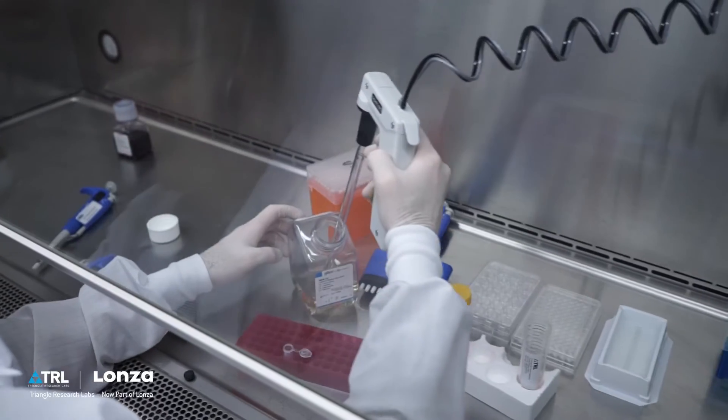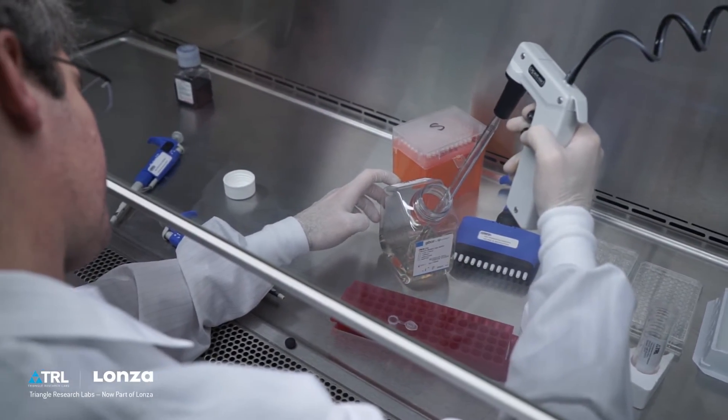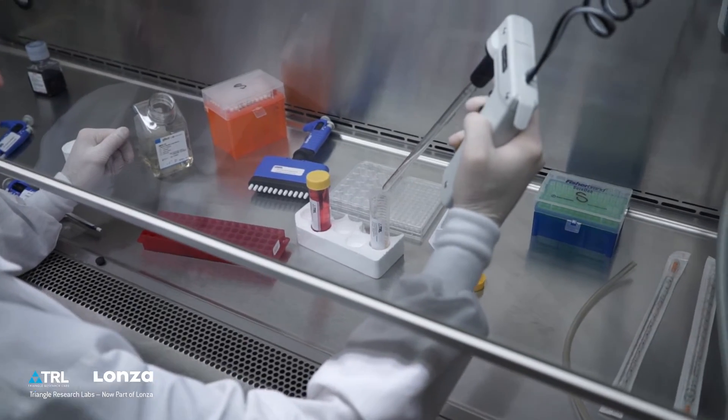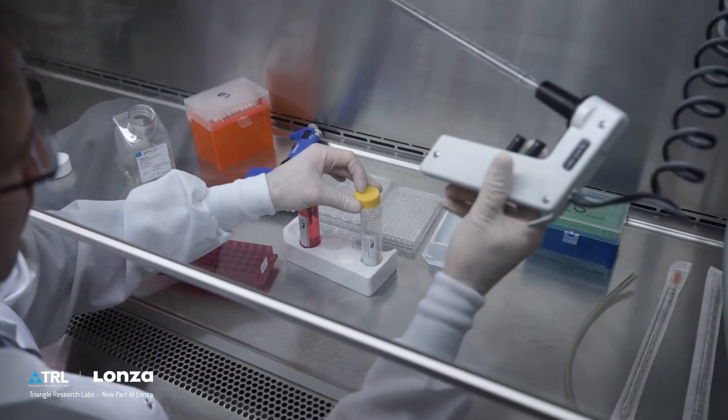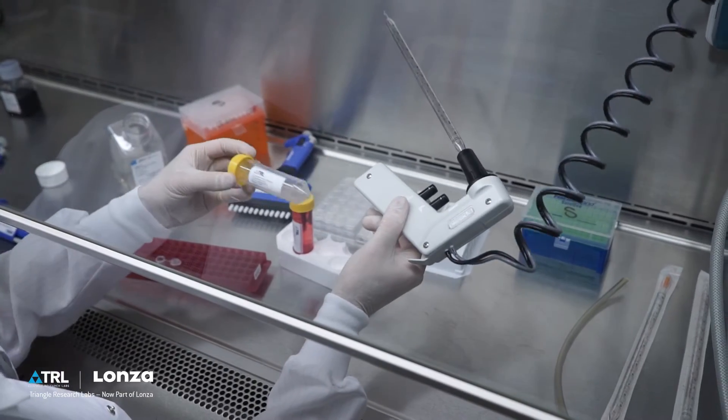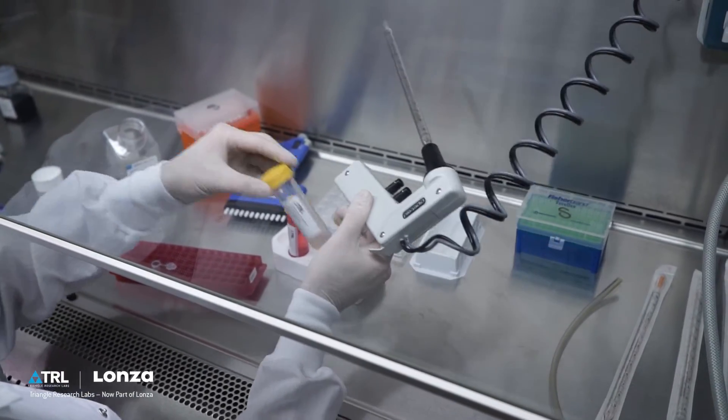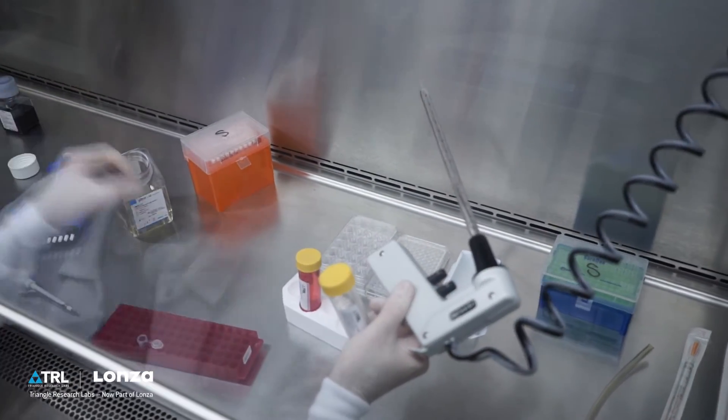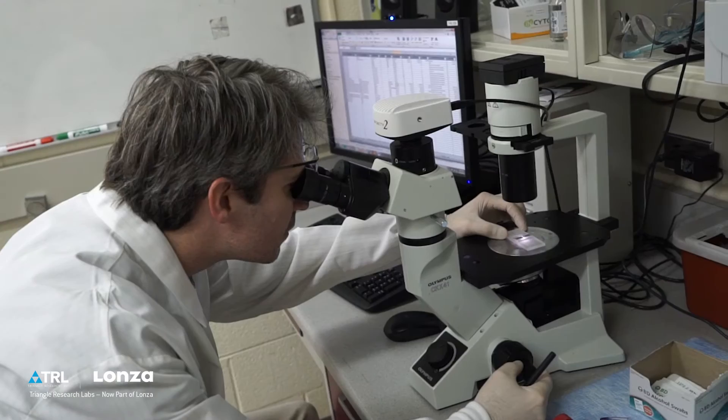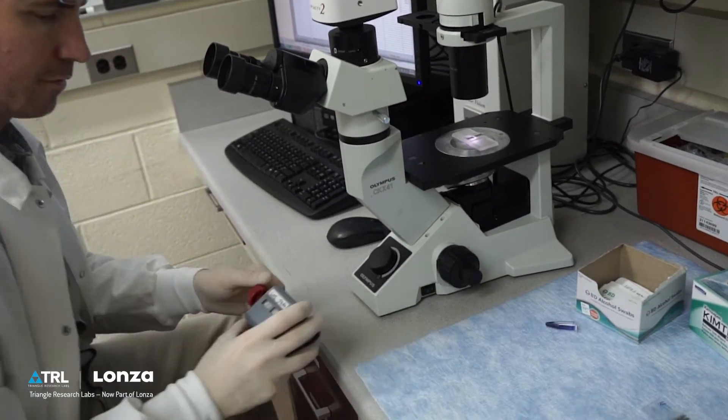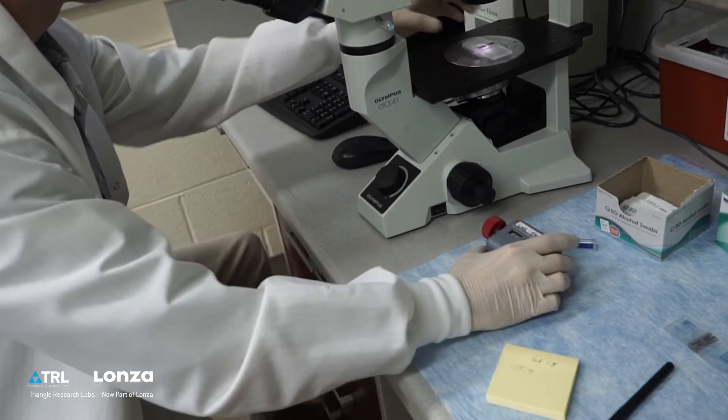Resuspend the cells by adding approximately 0.8 milliliters of plating medium per million cells expected. Gently rock the tube back and forth. Count the cells to determine the post-thaw viability and yield. Refer to the Trypan Blue cell counting protocol.